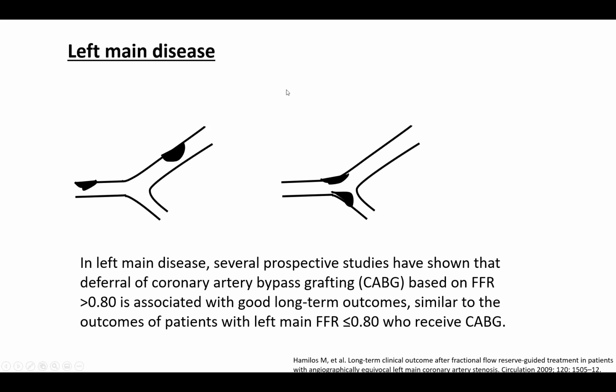I would like to continue with this talk and provide for about 15 minutes, for those who can stay, a description and illustration of FFR and IFR use in other important settings. So I will keep going here. And first, I will describe the application in left main disease.